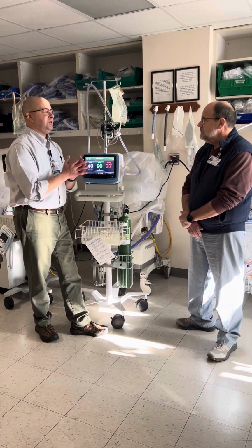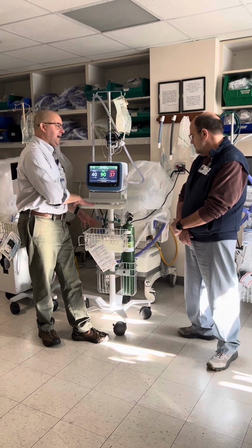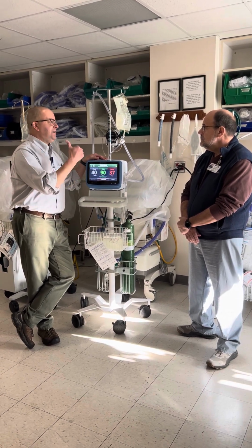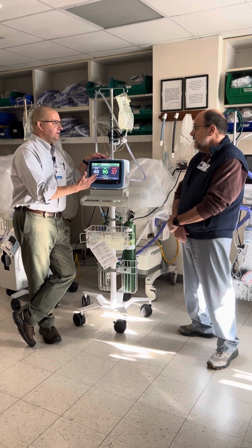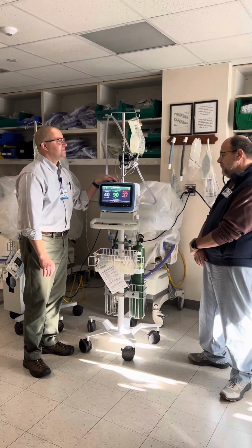Or let's say your patient needs to go to CAT scan, and we don't want to take them off their therapy because we want to continue it. We can put tanks on and transport the patient on this. The other thing I would love to get to eventually is getting PT involved, getting our patients up and mobile. We can remove the barrier for people who are high flow or high O2 dependent, so we can actually make them more mobile.